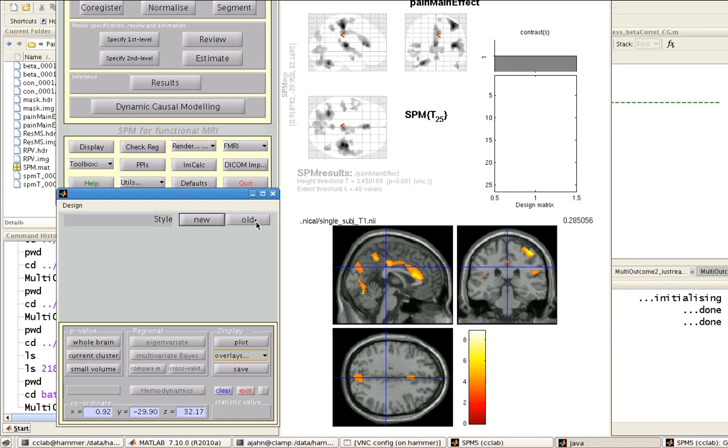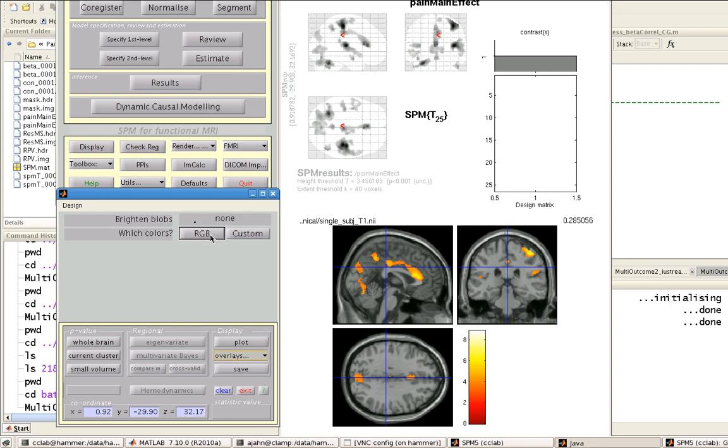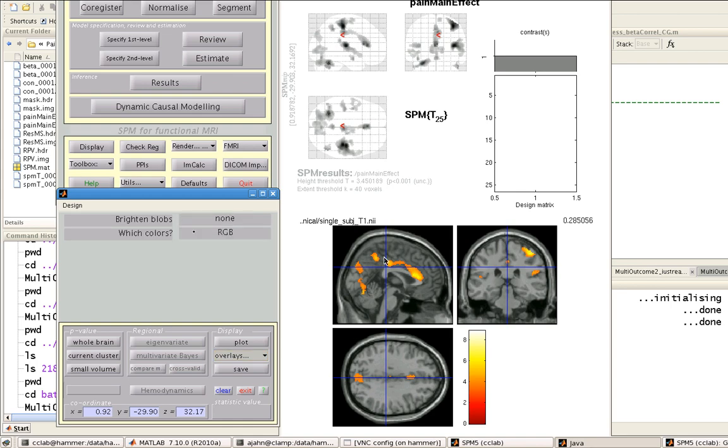Style, either new or old. The old is going to look a little bit more like this. It's going to be more of a heat map, where new looks more like it's been spray painted on. I'm going to select new. I'm not going to brighten the blobs at all and select RGB for the colors.